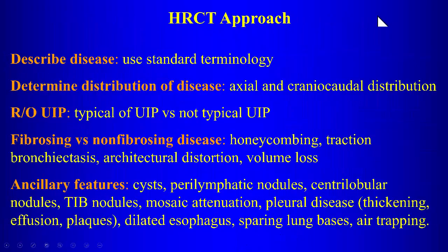Okay? Now, in terms of the approach as radiologists, in most cases we're going to be dealing with the appearance of these diseases on high-res CT.